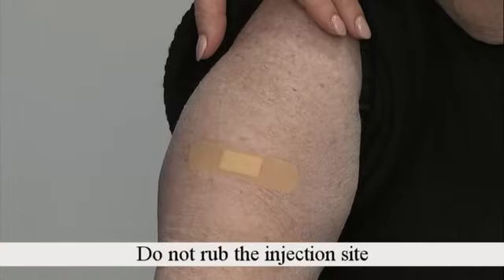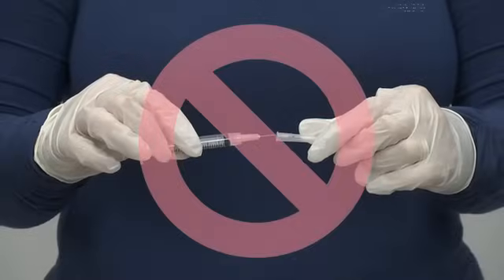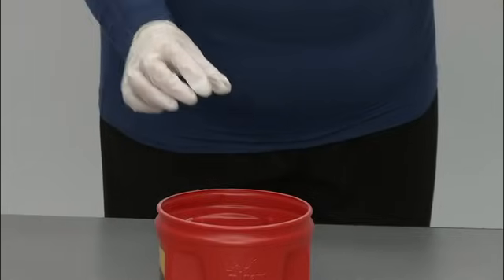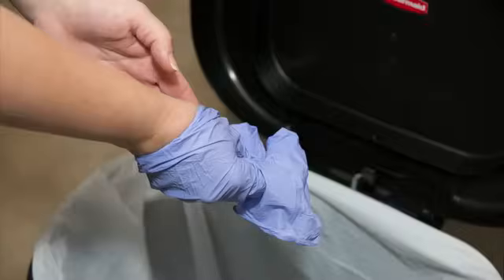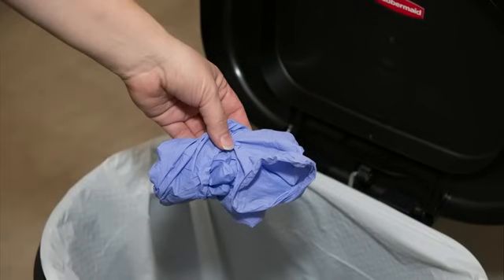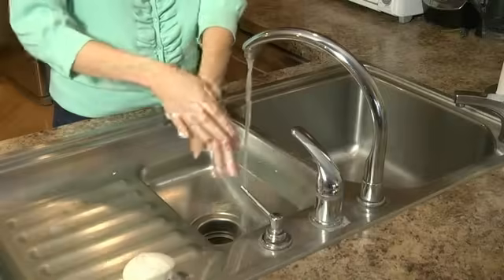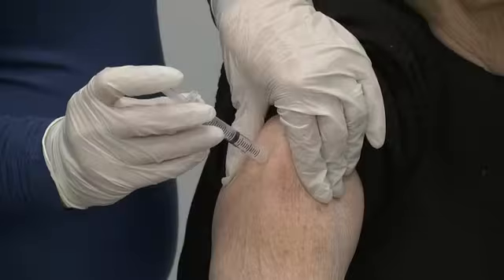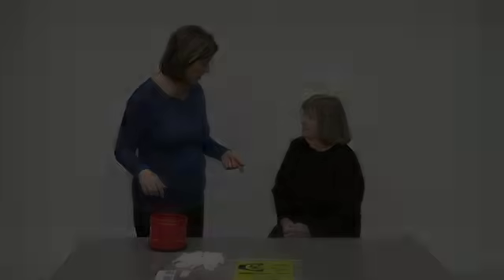Do not rub the injection site. Do not put the cap back on the needle. Drop the entire syringe and needle into your container for used sharps equipment. Take off your gloves and throw them in the trash if you're giving the injection to someone else. Wash your hands with soap and water. If you have any questions about the subcutaneous injection procedure, please ask your healthcare providers — they are happy to answer your questions and concerns. Thank you again for choosing Cleveland Clinic for your care.